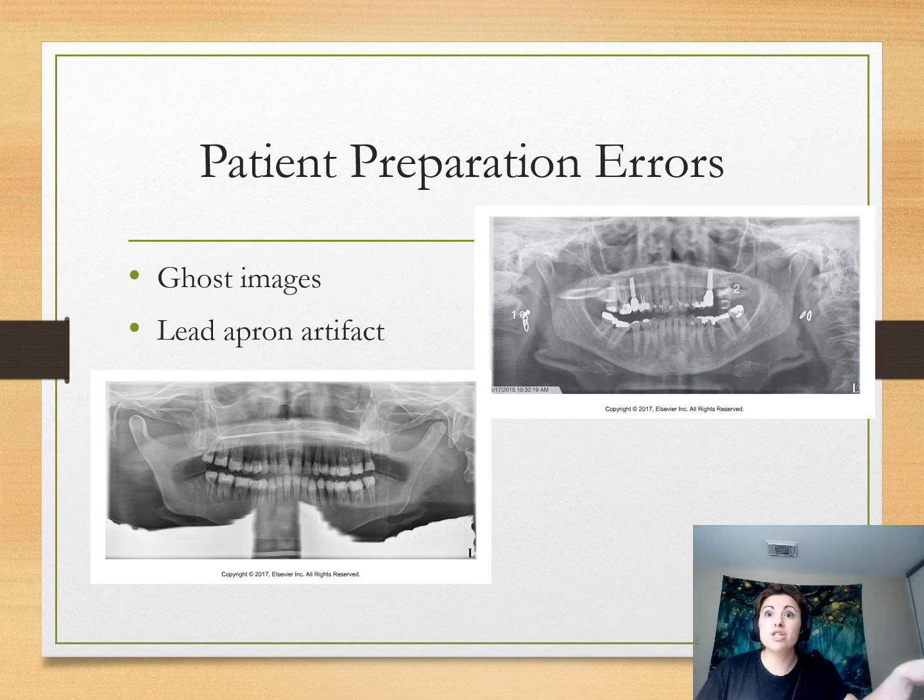Sometimes women don't like taking their hair down when they come in for the dentist, and you just need to explain to them. If you say, okay, I need you to take all that stuff out of your hair, and they say no, then you just say, it's going to show up on our x-ray and it's going to cover the images that we need to see. There's really no point in taking this x-ray if you're going to leave that stuff in your hair, and we really need this x-ray, so you need to do it. And usually they comply.